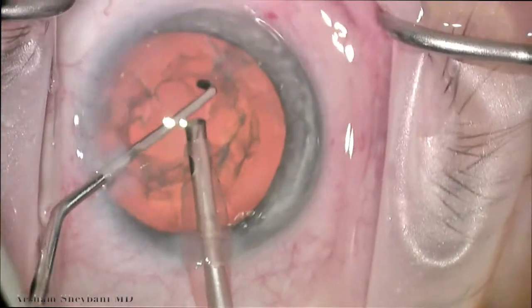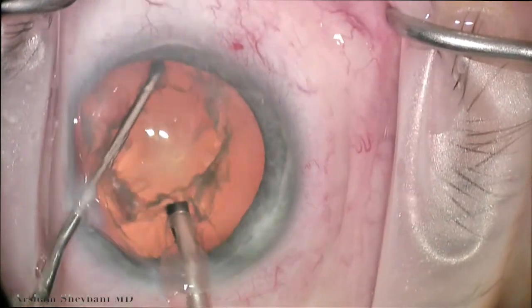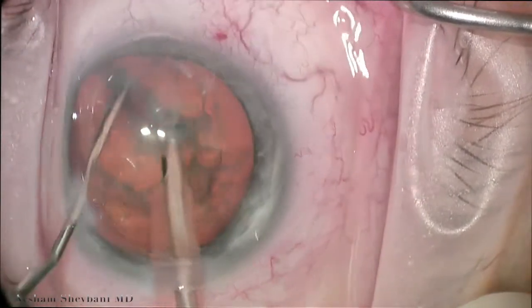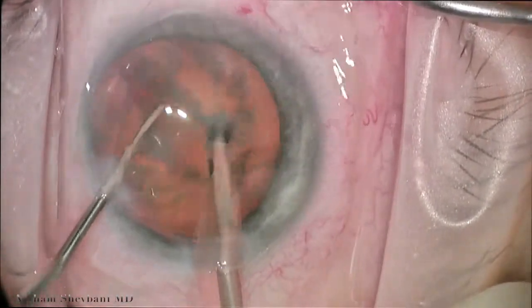We're going to hydrodissect. And then again, another Katena instrument here is the Milder chopper. This is my preferred chopper. It's a combination horizontal and vertical chopper. It has a flatter blade with a sharp front tip, which makes it great for even divide and conquer surgeons.